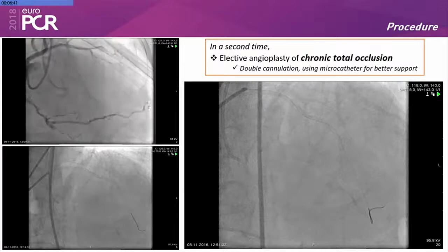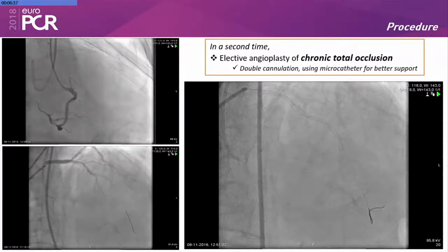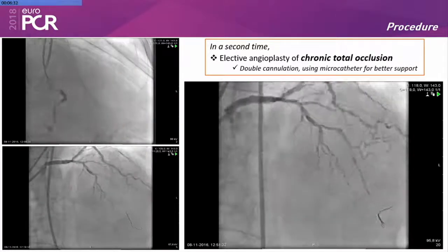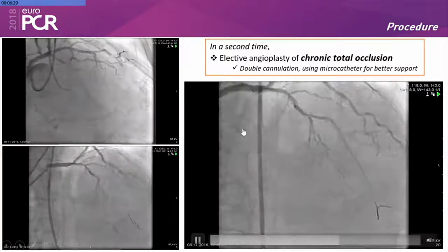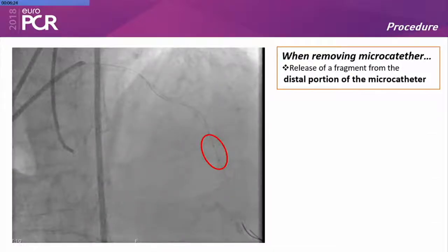In a second time, an elective angioplasty of the CTO was scheduled. We used a double cannulation and a microcatheter for better support. After successful passage of the guide wire, when we were removing the microcatheter, we observed the release of a small fragment from the distal portion of the microcatheter.